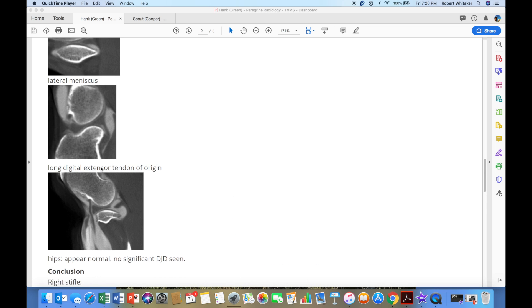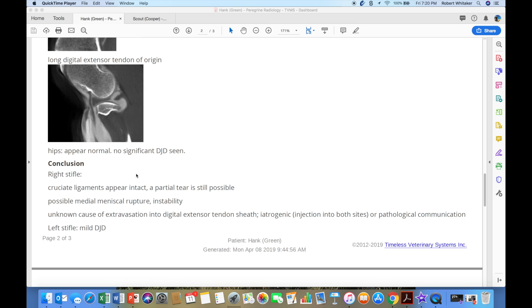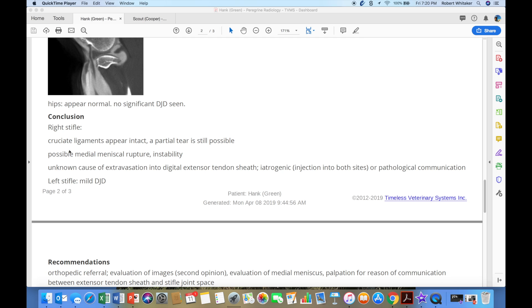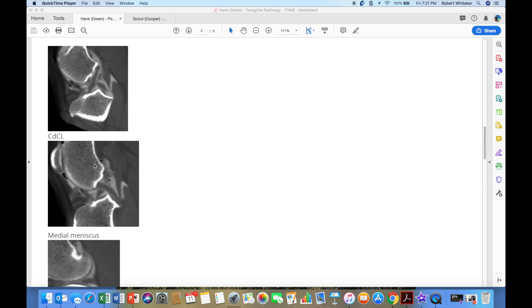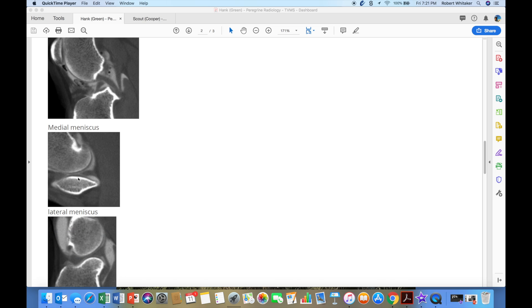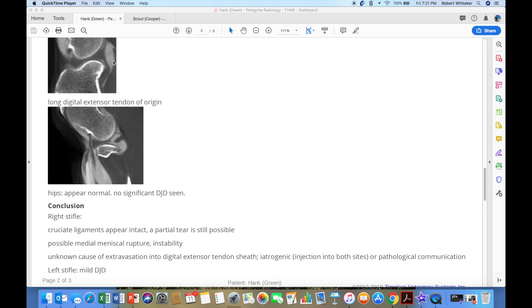There were hip images, but everything was normal, so they didn't see any significant pathology. Dr. O'Brien goes on to say cruciate ligaments appear intact and partial tear is still possible. Medial meniscal rupture — he's thinking there could be a rupture in the medial meniscus right here, given that there's contrast material flowing through that area. So that kind of wraps up what we've done with Hank.